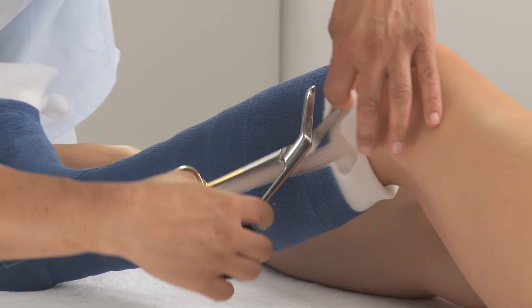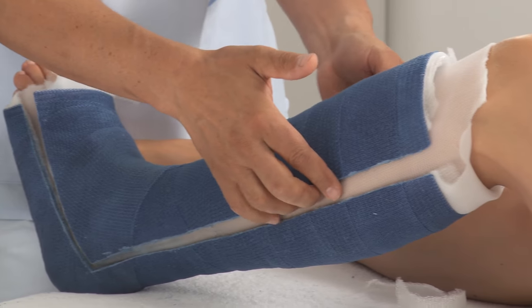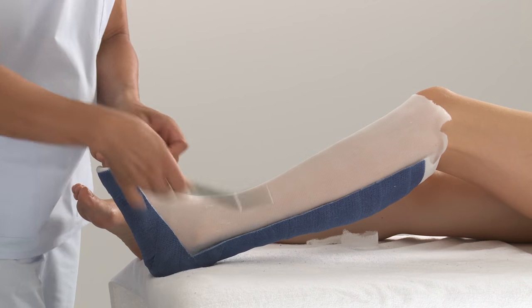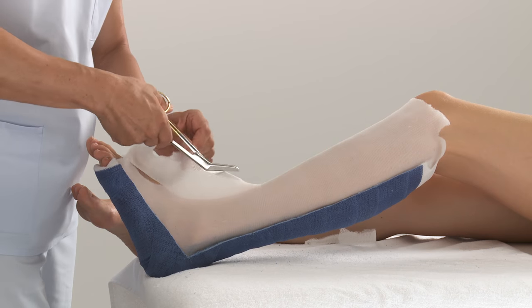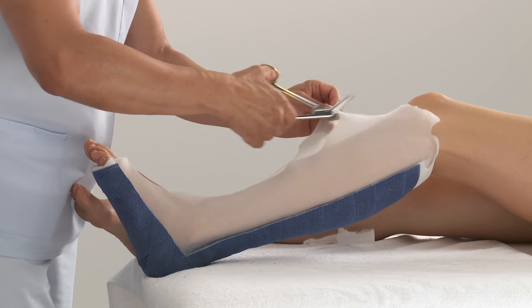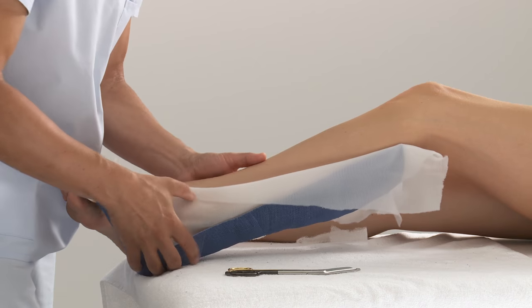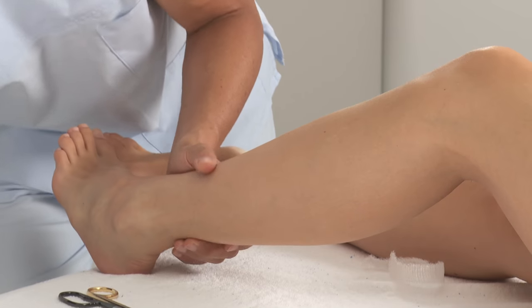Cut along the proximal edge of the stockinette to allow for separation of the two cast halves. Remove the top half, then cut through the second layer of the stockinette. Remove the second half of the cast and the stockinette.